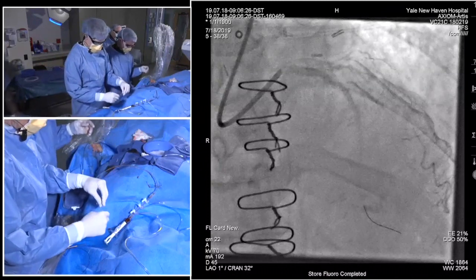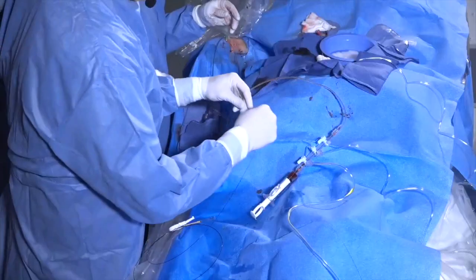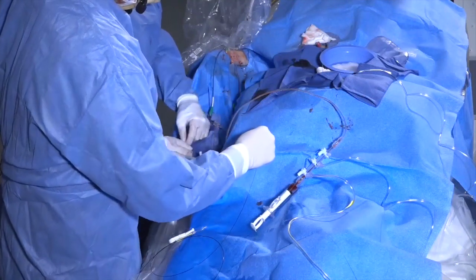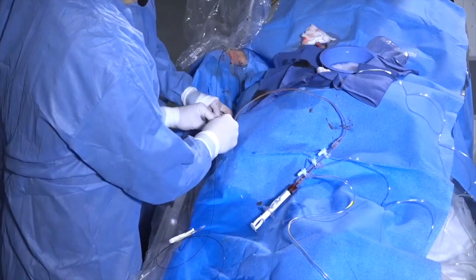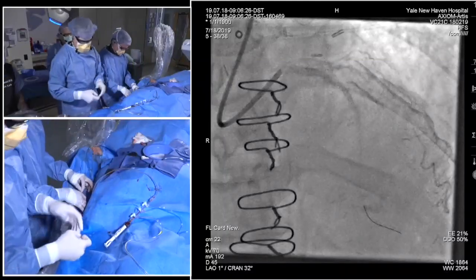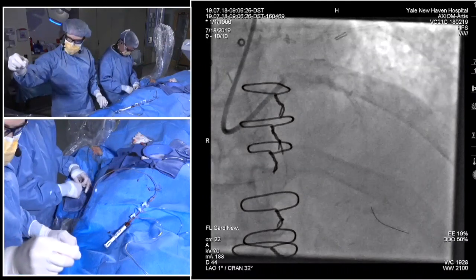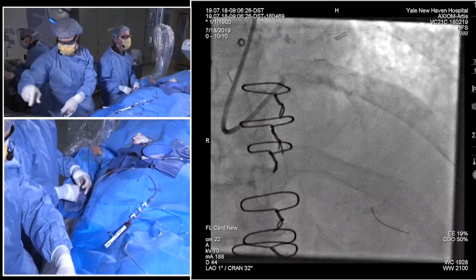So a really important thing that was just shown there is they did a test injection and you saw slow flow in the vessel. Now sometimes that can happen during the rotablation as well. From a technique standpoint, especially for long runs, you do want to take test injections while you're ablating, because if you see that, then the absolute wrong thing to do is to continue to ablate. Right. What you want to do is reverse the slow flow, and whether that requires vasodilators, whether it requires neosynephrine to keep the pressure up, or other things before you increase the embolic load distally. There's some cases you may even have to aspirate a little bit to get rid of some of that debris, but here now they've shown it, they'll work on doing that.